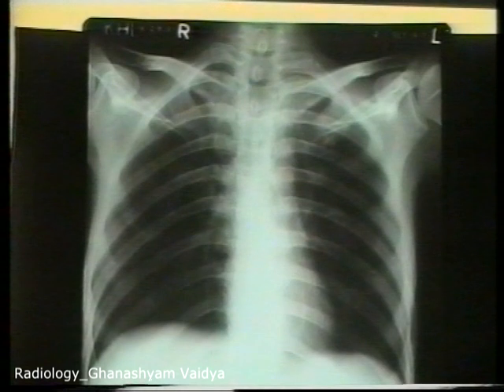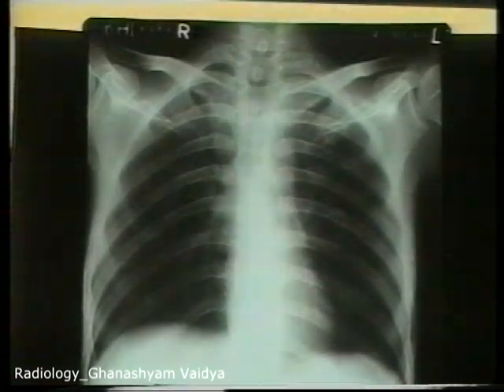Over the years, with experience, you become so familiar with the normal structures that a change will be recognized at a glance. But a good practitioner will never call an X-ray normal at a glance. Even the most experienced radiologist will study the film systematically and minutely before giving his opinion.